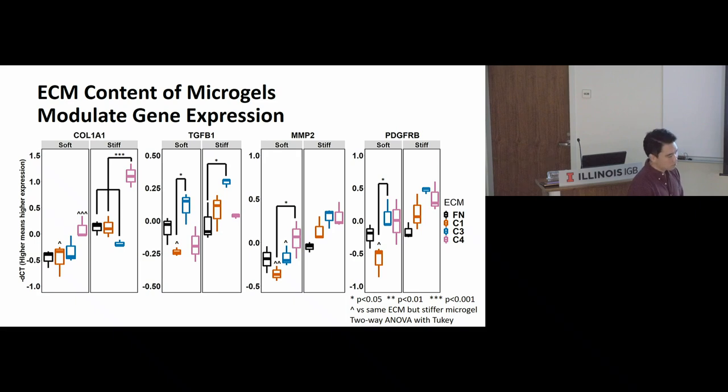But you could see that. I mean, you can encapsulate this still in Matrigel, so use the microgels as little highways for the cells to grow in. Or you could do your whole cell culture, then maybe stabilize the structure by using some kind of more porous gel. Not porous, but high mesh size, so you can still have that diffusion of antibodies. You can think of all of this to actually stabilize the structure. And at this stage, of course, the cells are not perfectly stabilizing, but they provide some.